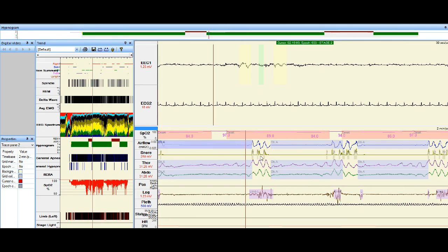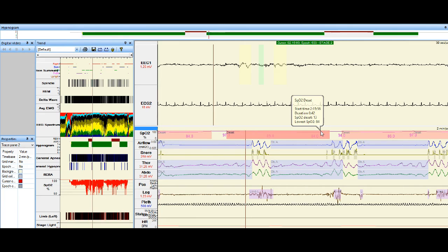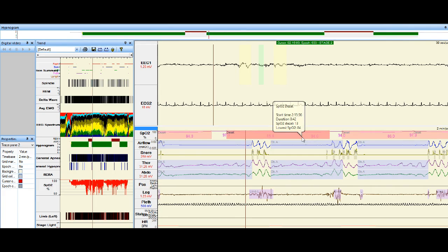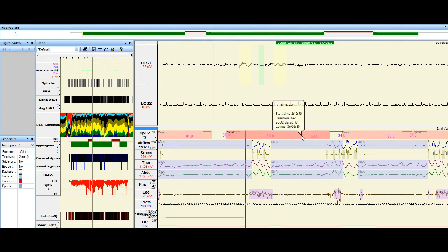So what I'm actually looking at here, I know it looks like a whole bunch of lines, but what we're actually looking at here is your SpO2 which is your blood oxygen level up the top here. Now we want that to be above 90. Remember you're sleeping, you should just be breathing normal, relaxed. The blood oxygen levels should be nice and high. If they're nice and high, this is going to allow the body to just relax and recover.